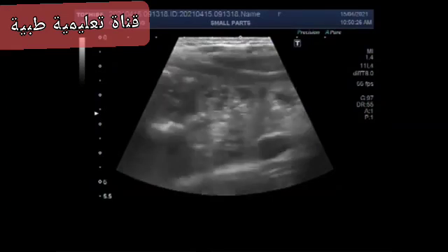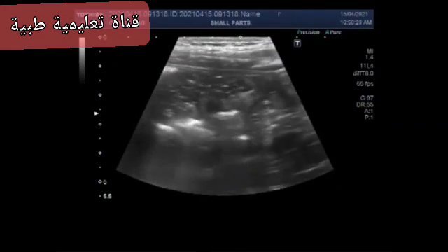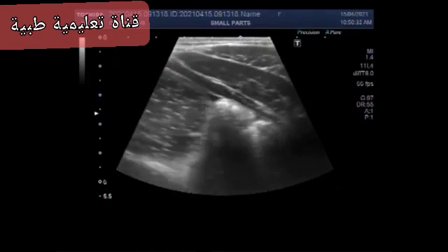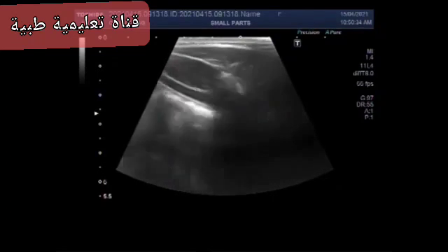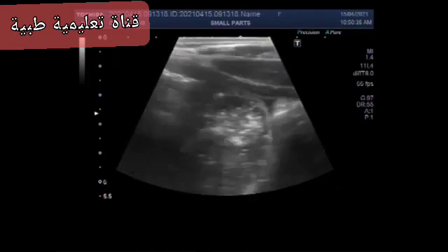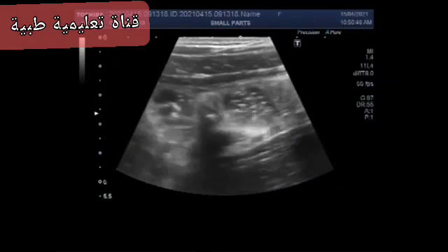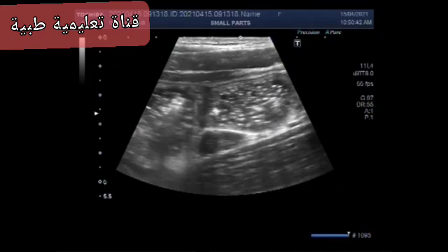This ultrasound video shows a case of localization of the inflamed appendix. Most often healthcare professionals suspect the diagnosis of appendicitis based on the symptoms, medical history, and physical examination. A doctor can confirm the diagnosis with an ultrasound, X-ray or MRI scan.